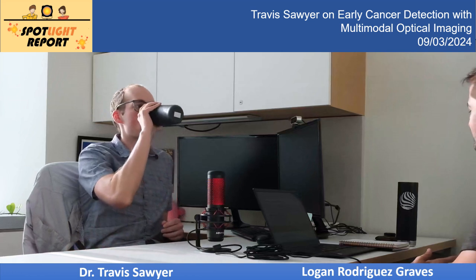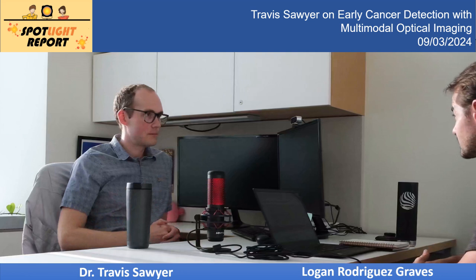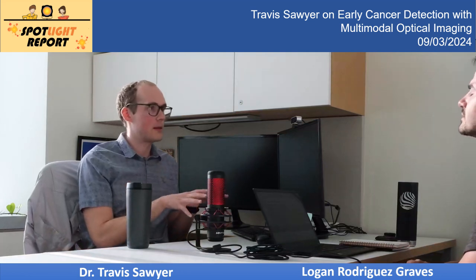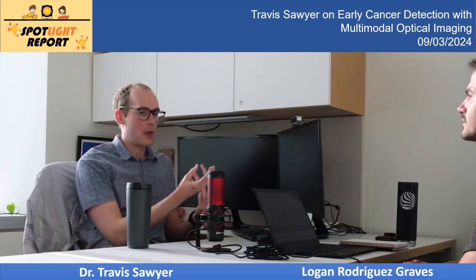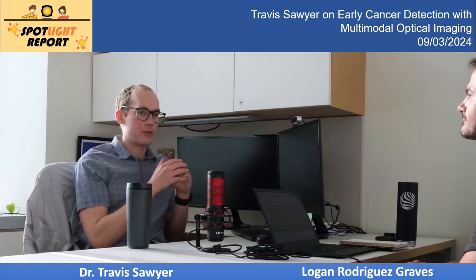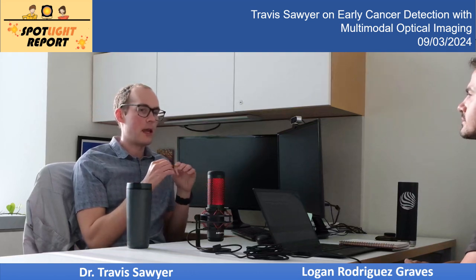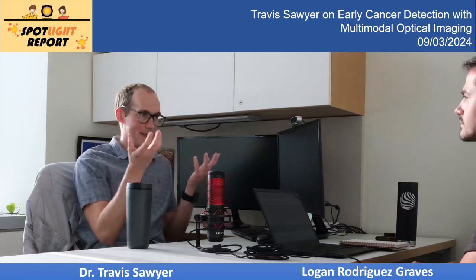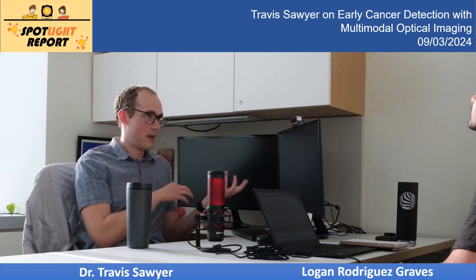space. Right. And so that brings us to the last one, which I want to say was multispectral fluorescence. Yes, so this was contrast agent based in this work. And so in this case, what you're trying to do is you find some biomarker. It could be a cell surface receptor. It could be a certain biochemical that gets spread out among the cells. And what you do is you try and conjugate a fluorophore, so something that lights up really well, with some kind of antibody targeted to that biomarker.